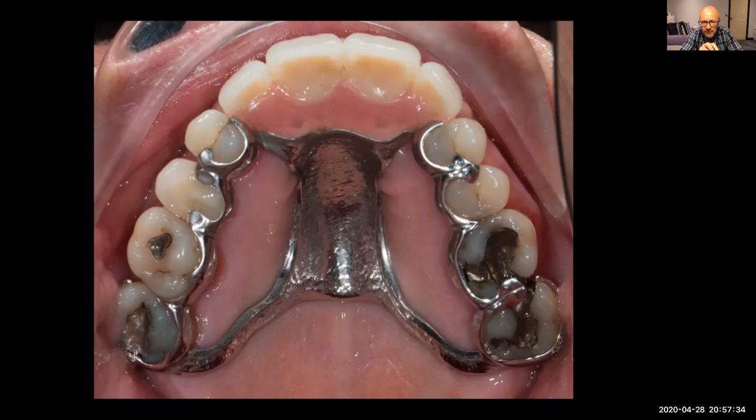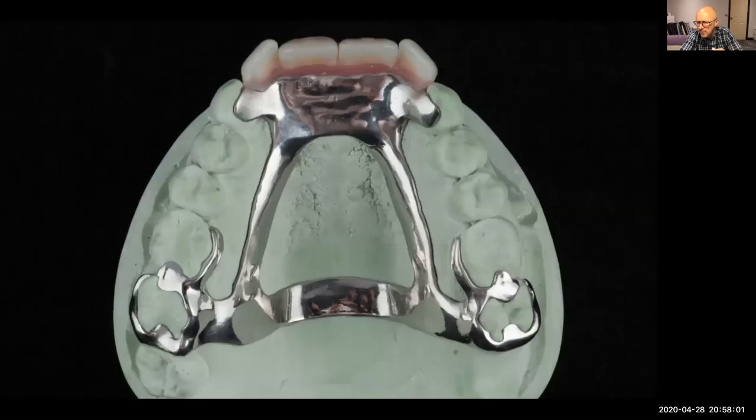If the patient's teeth are not heavily restored, but are potentially liable to be lost because of periodontal disease, then I would take the backing just on the lingual surface and not alter the occlusion. We just keep them in intercuspal position at the vertical they're used to. That's if the teeth are liable to be lost. If the teeth are not liable to be lost, like in this patient, for instance that premolar and these two here, which are unrestored and unlikely to be lost, then I don't have anything covering them. Keep it away. So that's great.